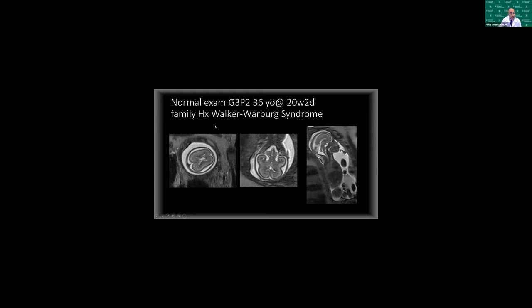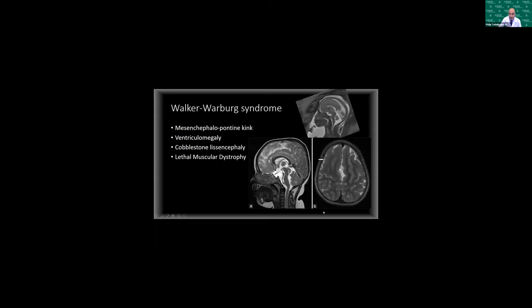Another case: a woman came in to exclude Walker-Warburg syndrome in her fetus. The images were completely normal, and we were happy to give her a good prognosis. Walker-Warburg syndrome is diagnosed by midbrain-hindbrain kinking and a lissencephalic appearance of the cortex with cortical cobblestoning. In our fetus, we didn't have any of those stigmata. This was early imaging so we couldn't say much about the migration pattern, but we were able to confirm that the stigmata of Walker-Warburg were not present.